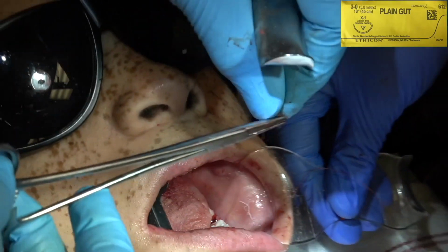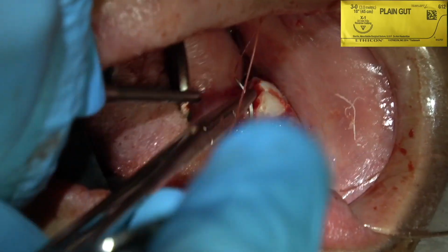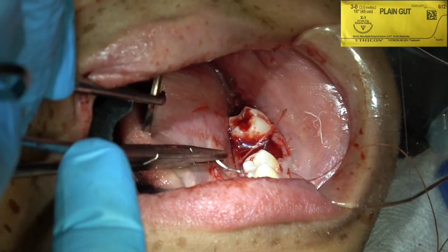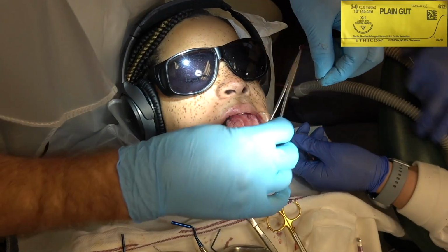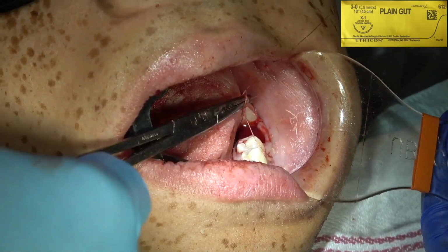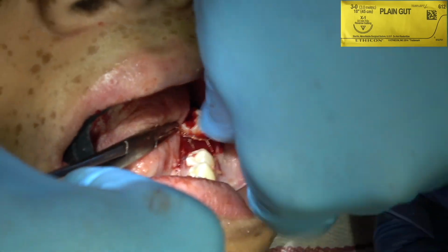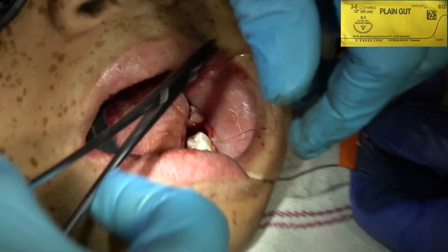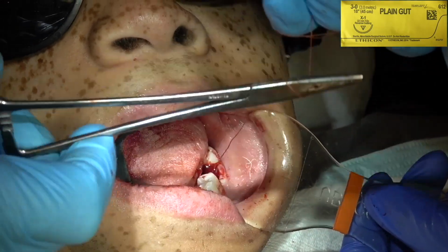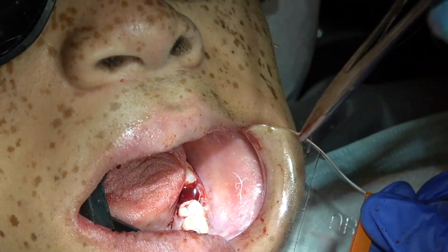Suturing with 3/0 plain gut suture. This suture will resorb in 4 to 7 days, and that's plenty of time for the flaps to adhere to the bone, to the alveolar process. And since I haven't reflected a big flap, only the coronal parts of the flap are having to adhere. I don't have a reflected flap down to the unattached or non-keratinized gingiva. So I normally place 3 sutures in a situation like this.